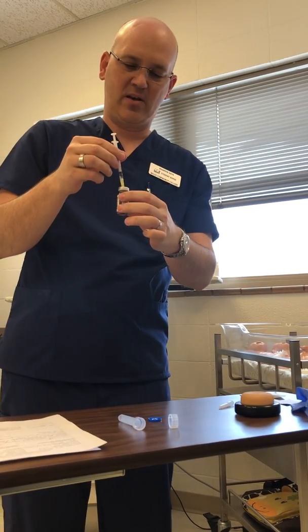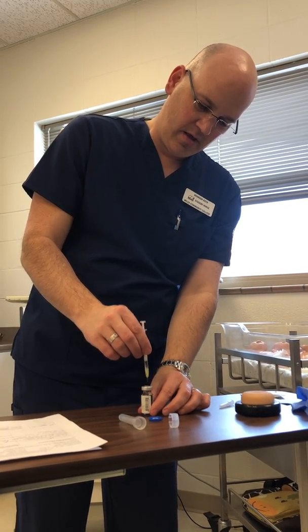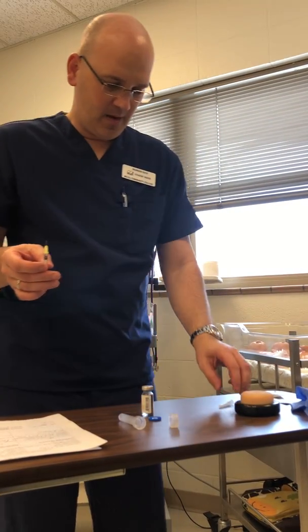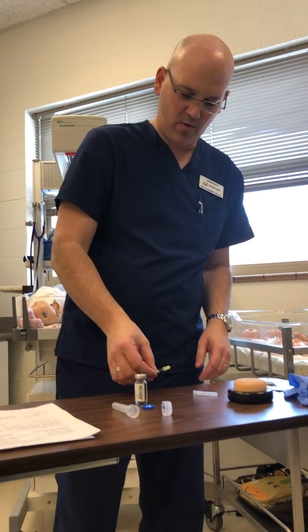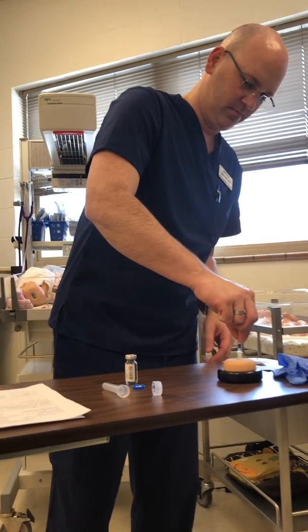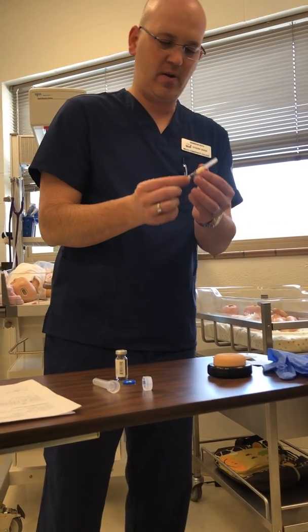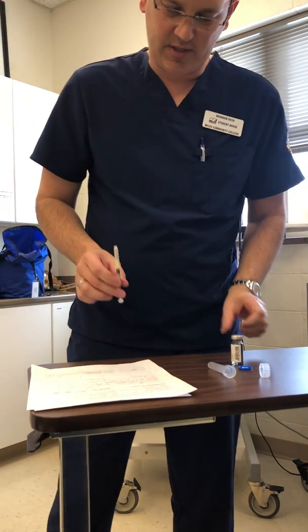We're going to tap it. We're going to turn the vial back over. The tapping is to get the air bubbles out, and we're going to pull it out. Now, because I'm not in the patient's room, or he's not in front of me at the moment, we are going to recap this safely. So it's been recapped. We're going to make sure everything's on tight without touching the top.